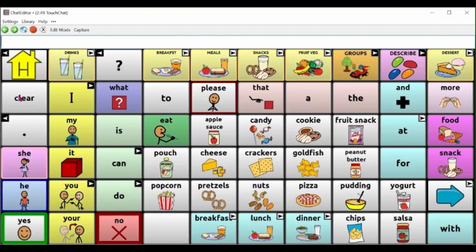If you're trying to give a choice, that's when you're going to want to narrow it down and say, okay, do you want to eat crackers or do you want a fruit snack? Fruit snack. And then we pause and wait. Generally, I recommend pausing for at least 10 seconds. It gives the child the opportunity to process what's being asked, especially because then we're making it into that directive, which is more difficult for them sometimes.